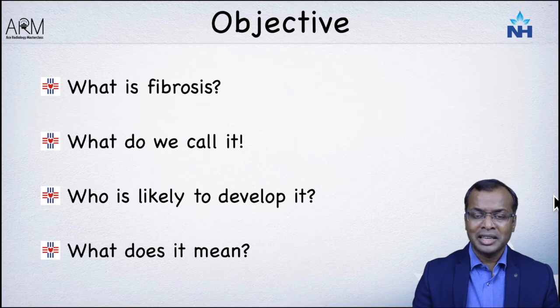I'm also going to tell you who is likely to develop this fibrosis compared to all the patients that we see. Finally, I'm going to try and discuss what it actually means to have this fibrosis. Does it have any clinical implications or not?